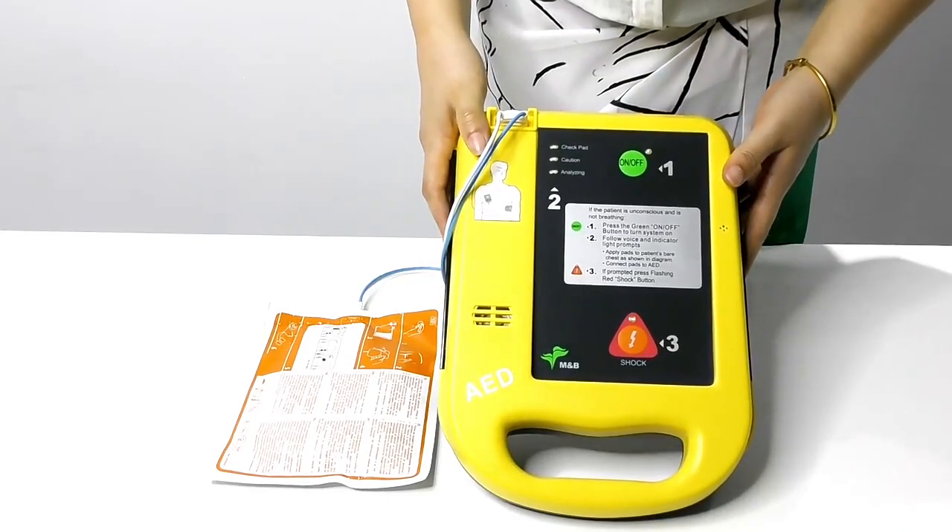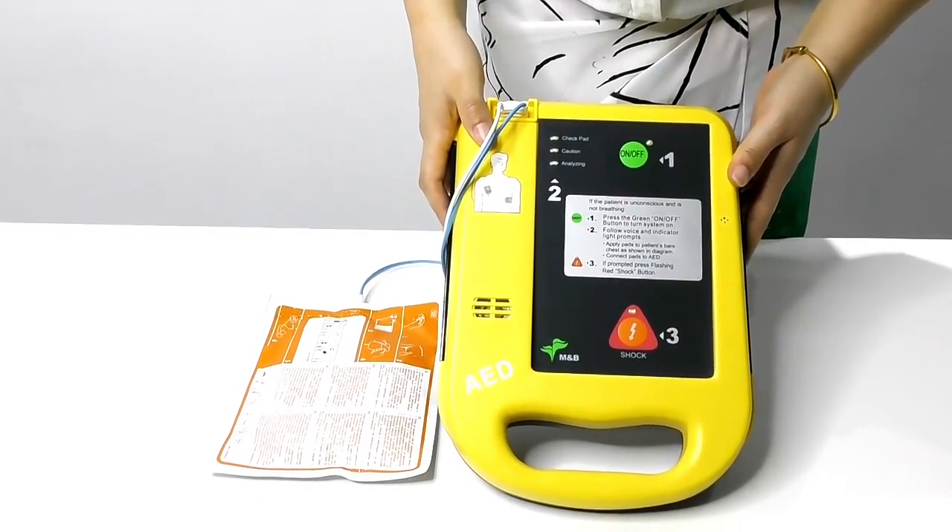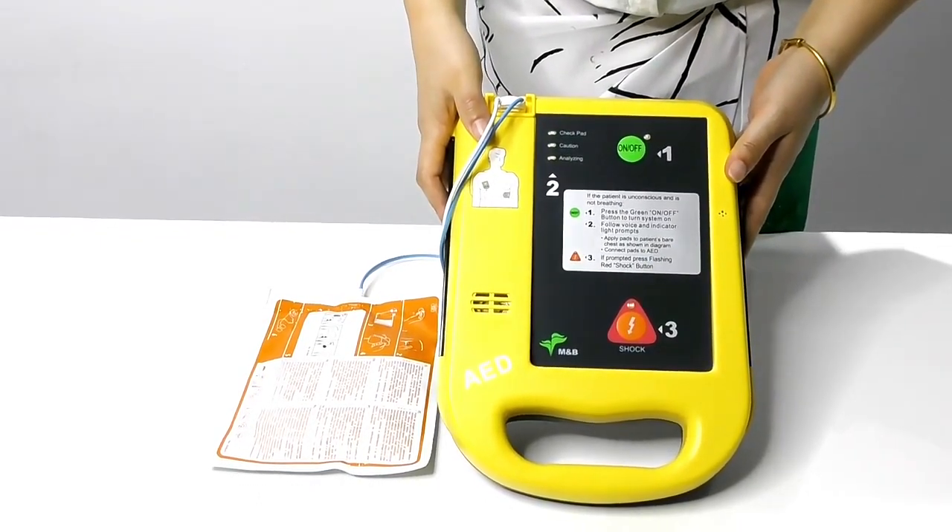Our AED-7000 has been in the European market for more than 10 years and has become popular and welcomed by various institutions. Thank you.